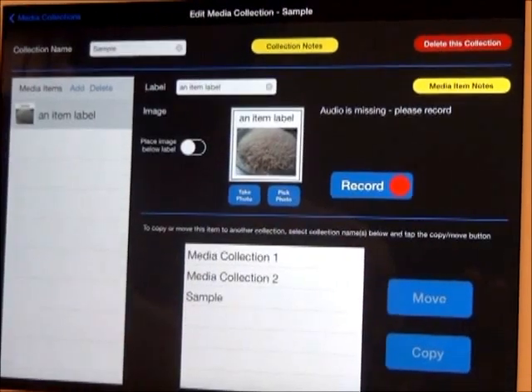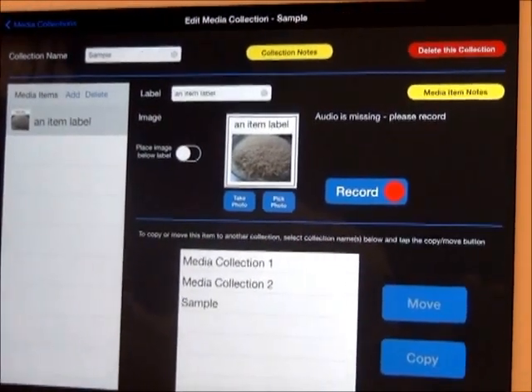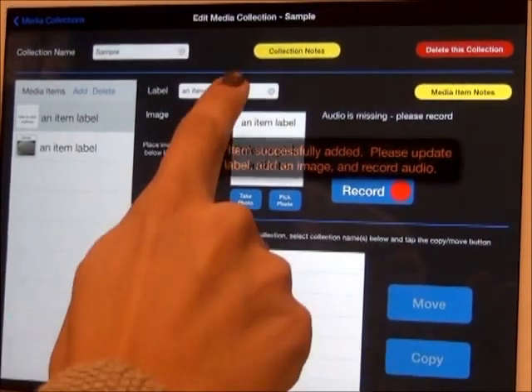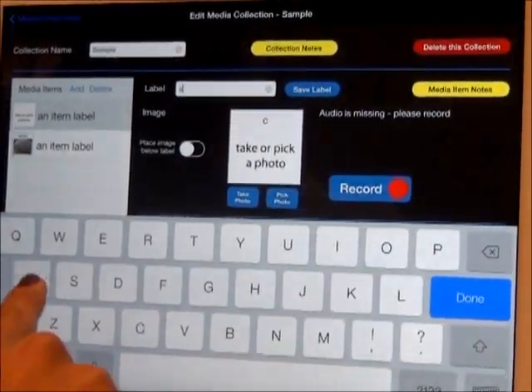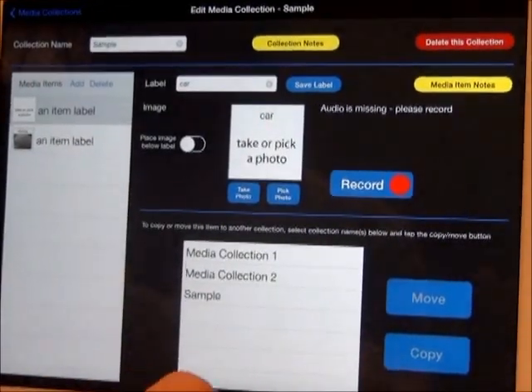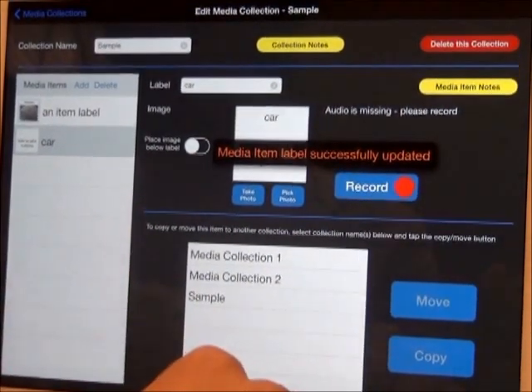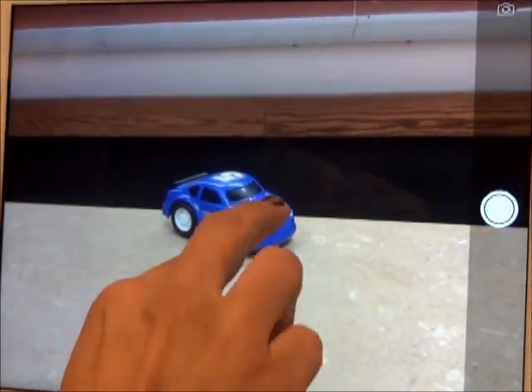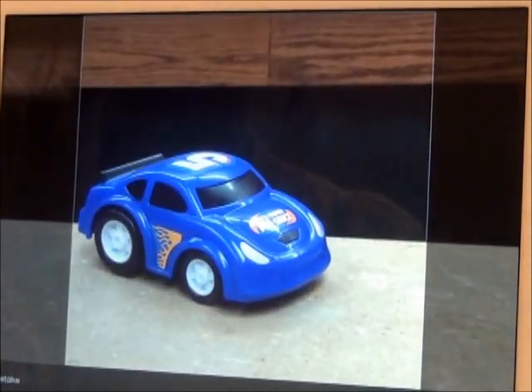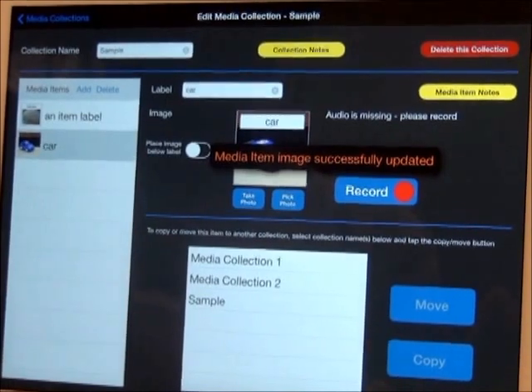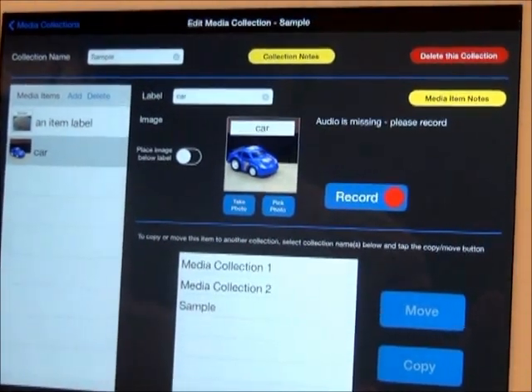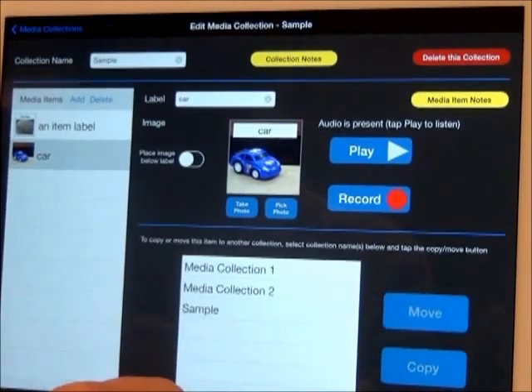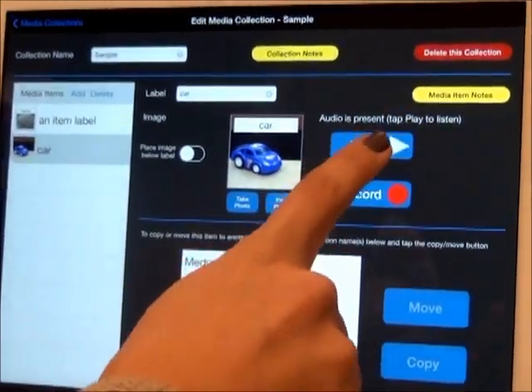Now I will show you how to take your own photo for a new symbol, using a car as an example. Click on the blue Add button, then label the new item. Be sure to save the label name. Now click on the Take Photo button. Zoom the camera to your satisfaction and take the photo. Select Use Photo. To record audio for the symbol, select Record and say the item name — Car. Play back the audio recording to confirm it is to your satisfaction — Car.